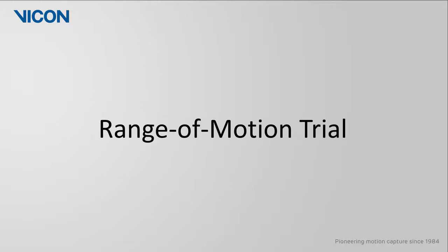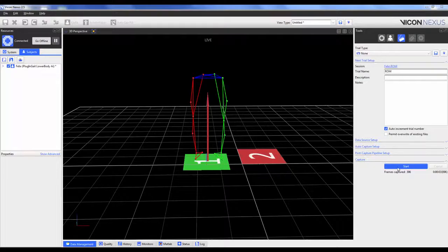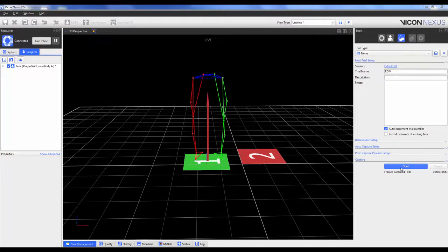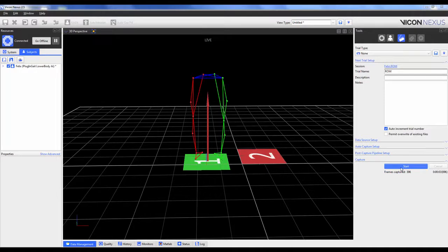A ROM trial allows Nexus to recalculate the labeling statistics within the template for each specific subject. This will help account for higher frequency and or higher amplitude marker movement resulting from a more dynamic and or flexible activity when compared to gait. As such, the physical movements performed by the subject in the ROM should at least mimic the joint ranges and velocities expected during the dynamic trials.